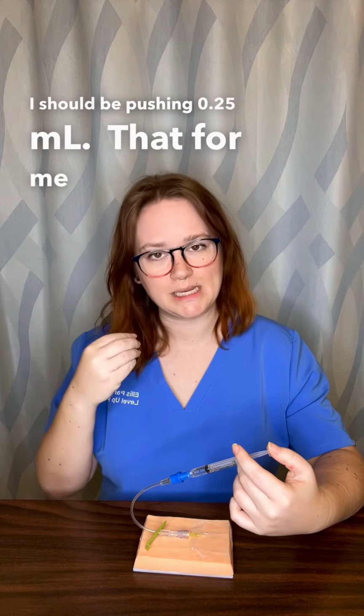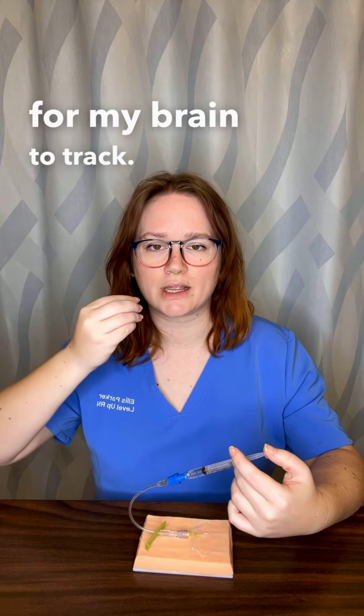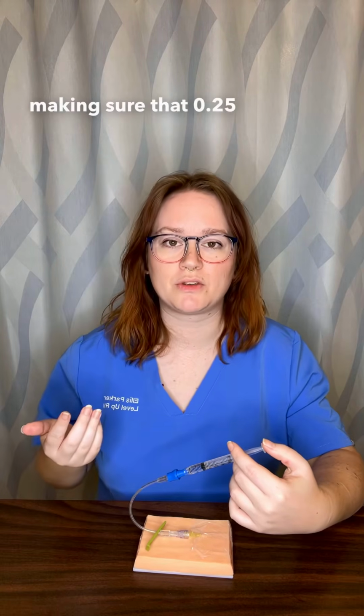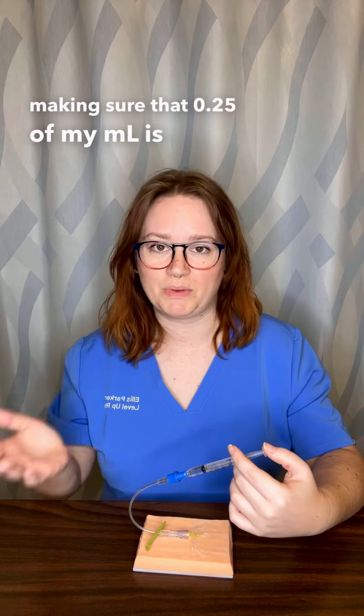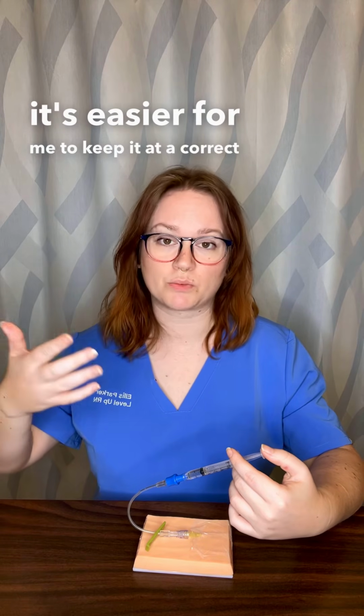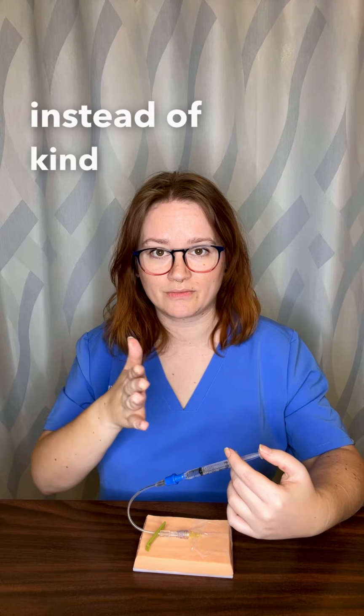And that, for me, is a lot easier for my brain to track. If every 15 seconds, I'm making sure that 0.25 of my milliliter is being injected, it's easier for me to keep it at a correct rate or pace instead of kind of going in spurts.